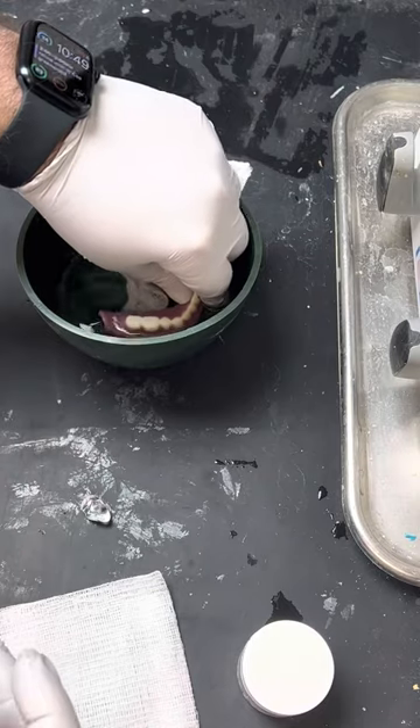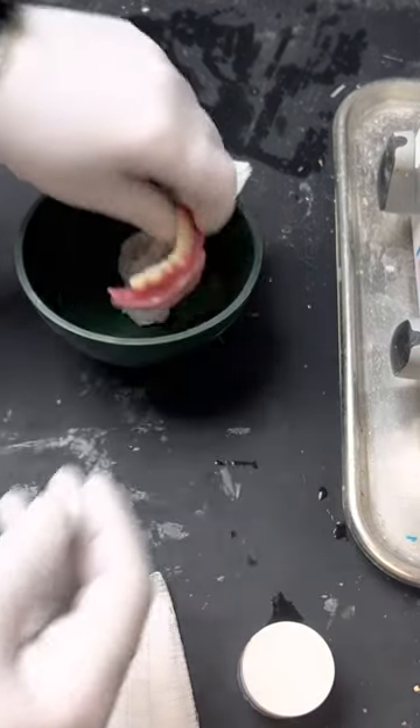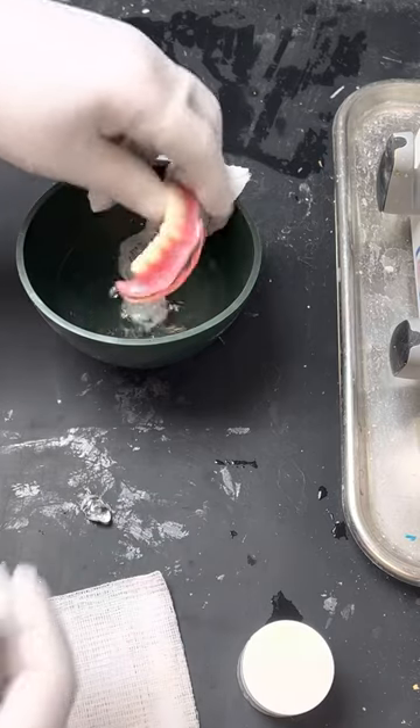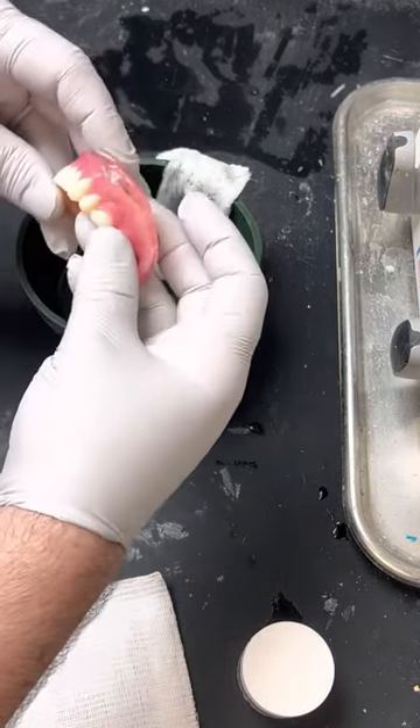You can put it back in hot water to temper it a little bit more if you need to, to make it a little bit softer. And you can just border mold with this, just like you did with compound.